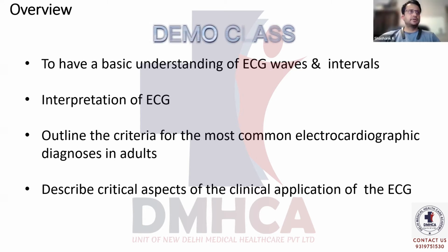Last time we talked about some of the basic understanding of ECG waves, but anyhow, I will go through them as I mentioned. And we also spoke about what an ECG is. It's basically the electrical conduction of your heart. By examining the changes from the normal on your ECG, you can identify a multitude of cardiac disease processes.